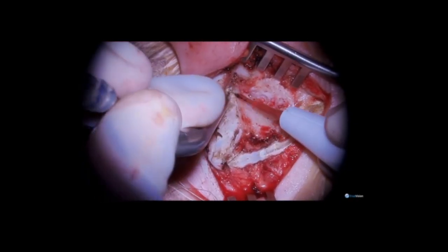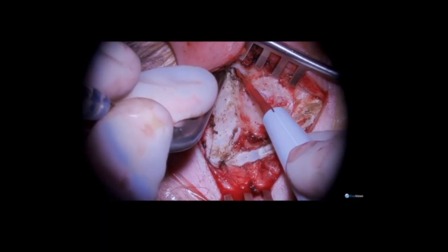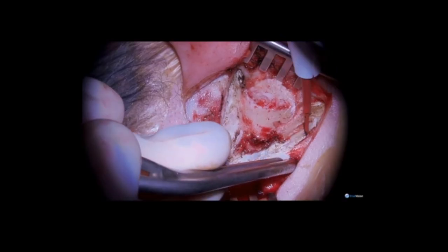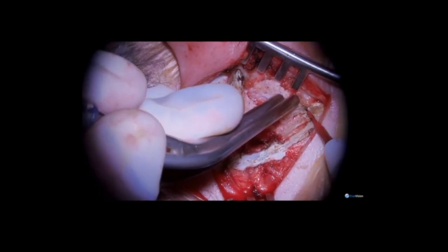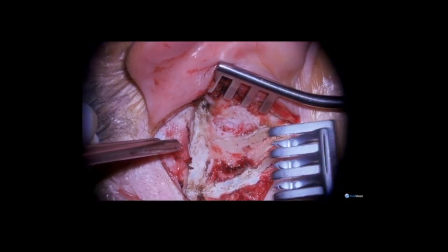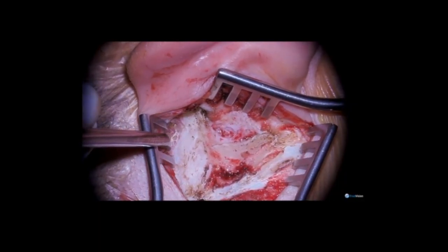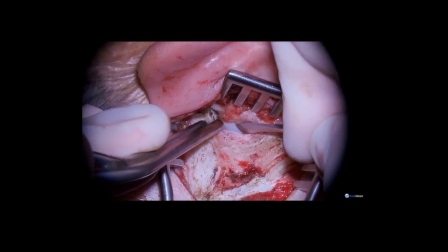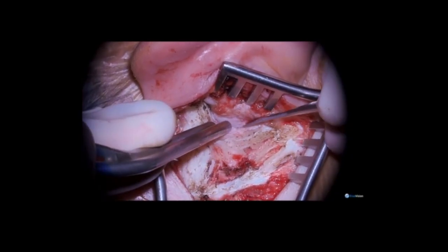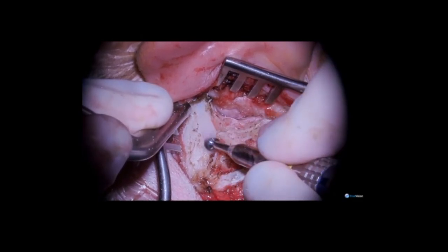I then undercut the temporalis muscle so a second retractor can be put in place, because a good mastoidectomy must cover the territory superior to the external auditory canal to properly access the attic region. At this point, I am bluntly elevating the skin of the external auditory canal to get a good view of the position of the canal wall to perform an intact canal wall mastoidectomy.